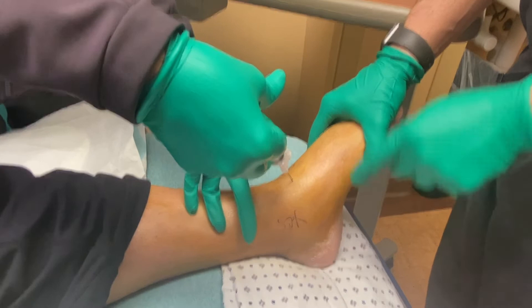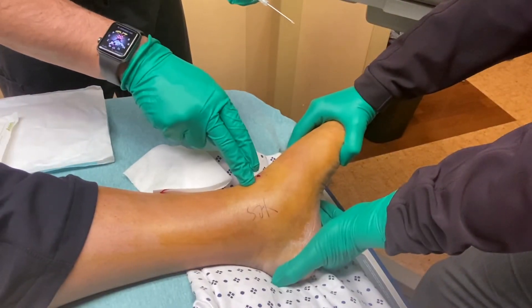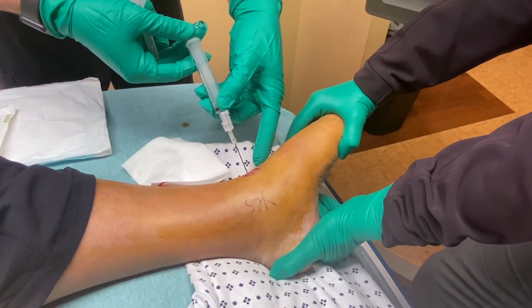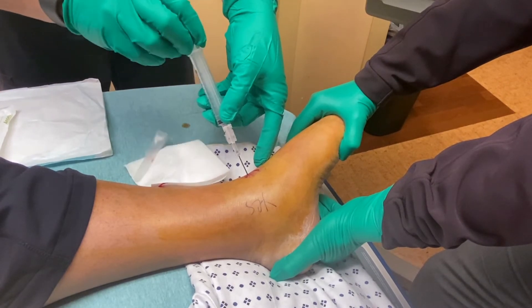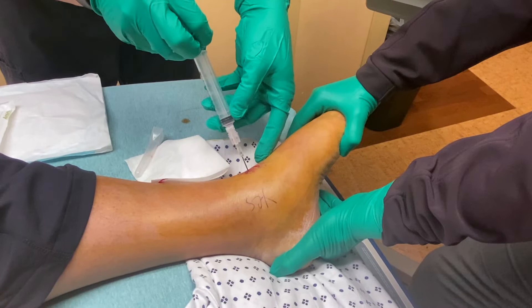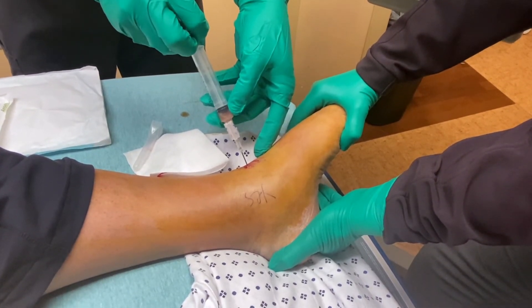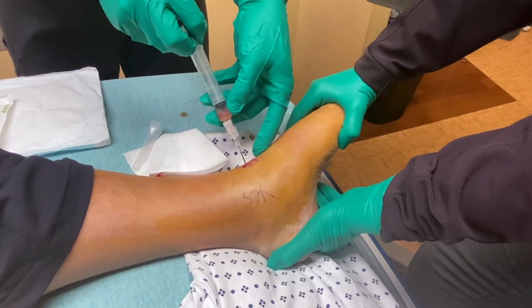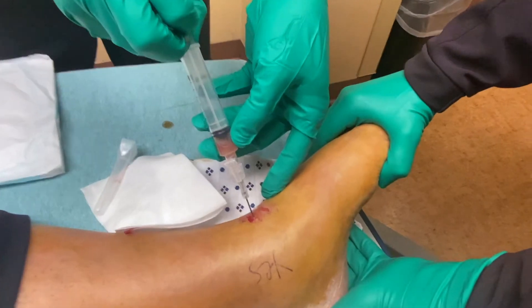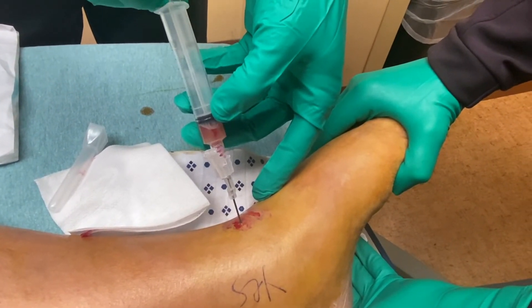The fifth step: if you haven't gotten any fluid yet, withdraw your needle almost to the skin before adjusting, to avoid lacerating the deeper tissues. Once you're in, withdraw as much fluid as possible for all of your diagnostic tests, as well as to alleviate some of the pressure within the joint. If the fluid stops flowing, you can attempt to slightly advance or rotate your needle by 90 degrees in either direction, as the bevel may be obstructed by tissue or debris. Finally, withdraw your needle and apply a dressing over the puncture site.